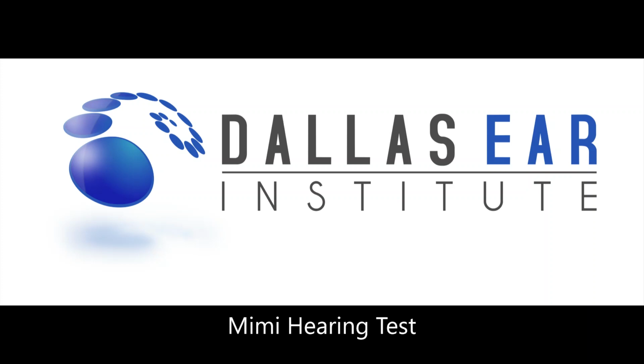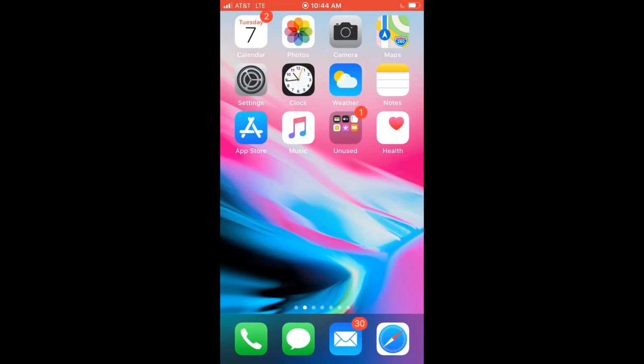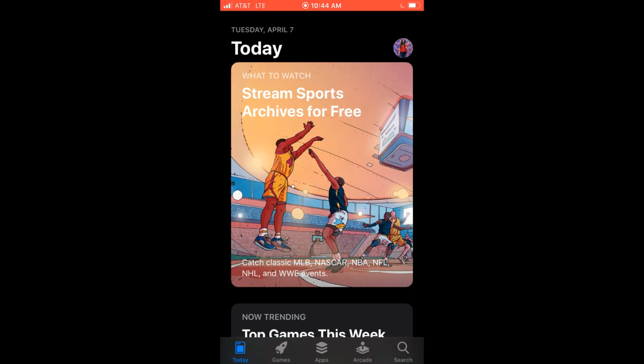I will be walking you through the Mimi hearing test today. It is an application on the iPhone looking like this, Mimi hearing test. And so you're going to go to your App Store. In the bottom right corner, click Search.